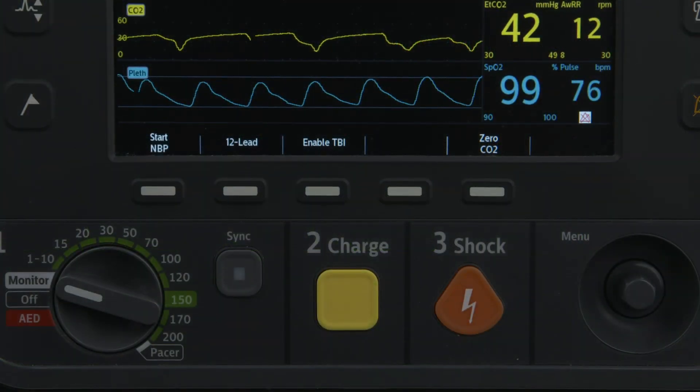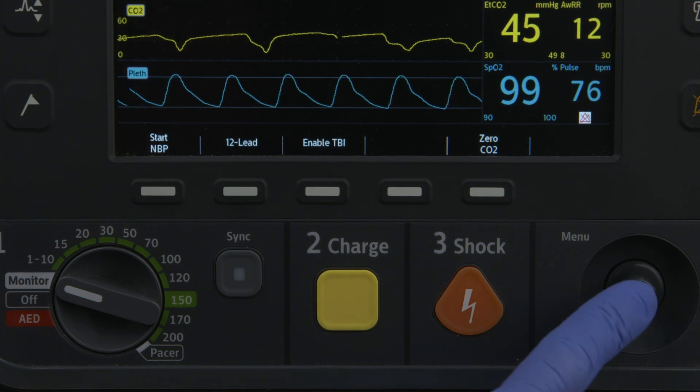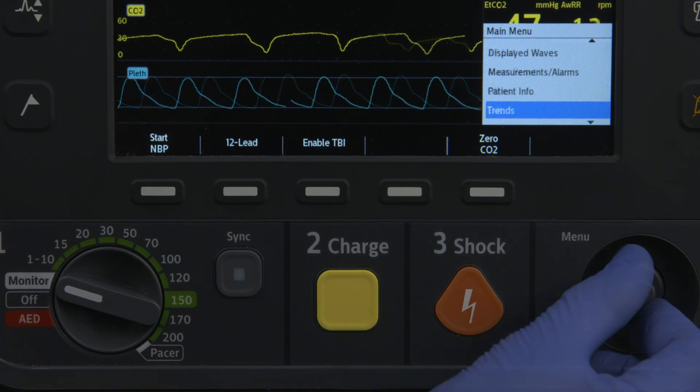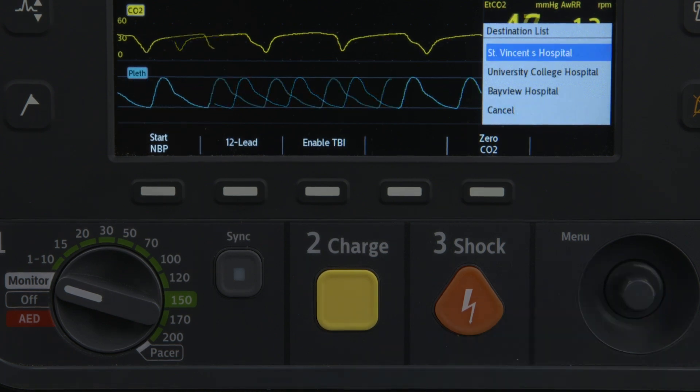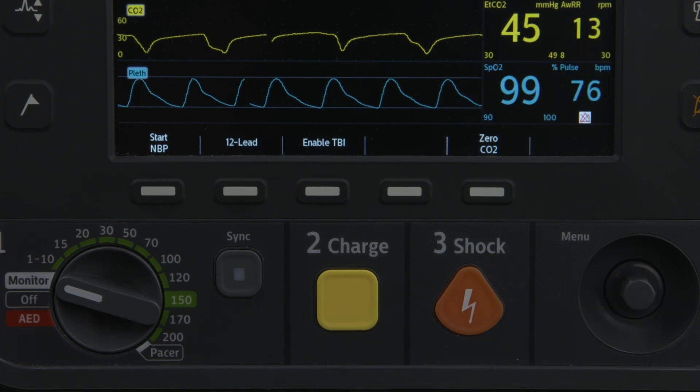To send vitals data, the HeartStart Intrepid must be in Monitor mode. Press the Smart Select knob and from the menu select Transmit Vitals. Select the destination with the Smart Select knob and the device will begin sending.